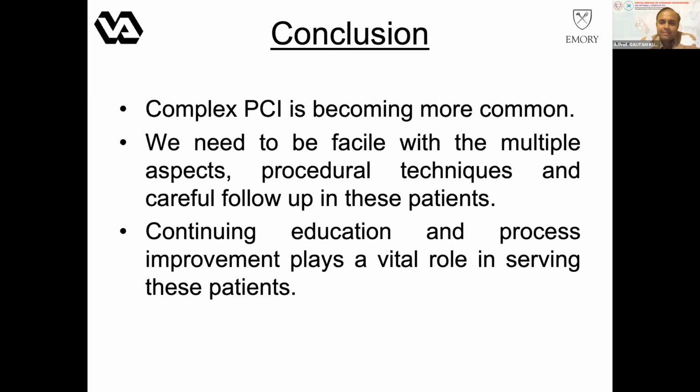The good news for us is that most of the drug-eluting stents from the common manufacturers, Boston Scientific, Abbott, and Medtronic, are all fairly comparable products with durable drugs. I would say Synergy is a biodegradable polymer, but the other two are durable polymer drug-eluting stents. I have found all three of them to be reasonably deliverable. There is one advantage of the Synergy, where you can have the 48mm stent that is available in the United States. I don't know if you have 48mm available in Vietnam.